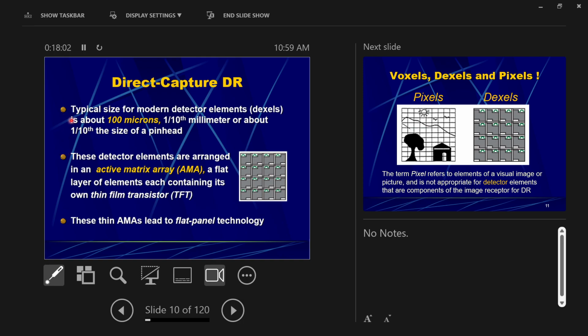Think about it like this, though. You can only see an object on a radiograph if the object is as large or larger than a single DEL cell, right? If an object is smaller than a single DEL cell, you can't see it, okay? That gives you a physical limit to the detail you can achieve. The DEL cell is the thing that physically limits what you can see. Okay, ignore focal spot and the source to image distance and all that stuff from principles of exposure for right now. The DEL cell is what actually limits what you can see.